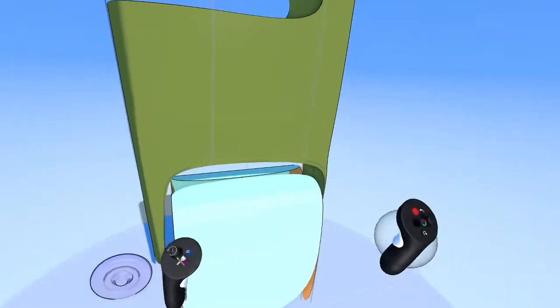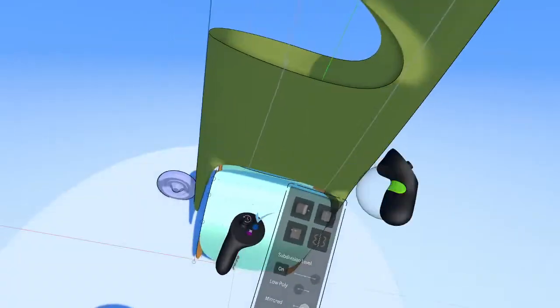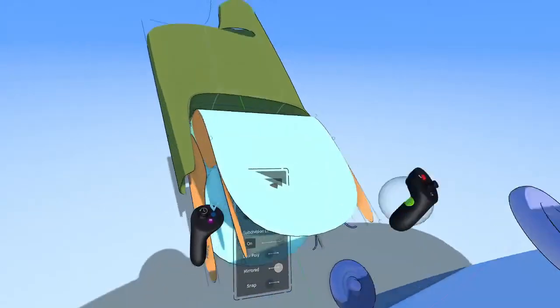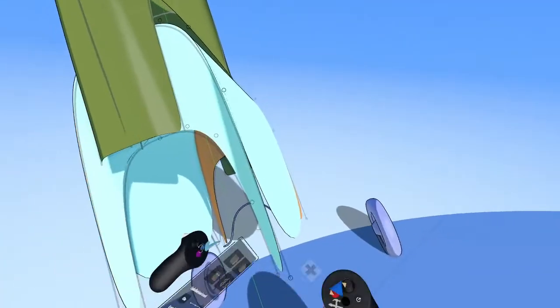All right, so let's keep building this guy out. Let's start down here with the legs and merge all these together here.